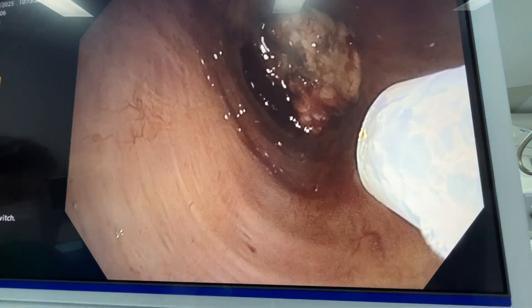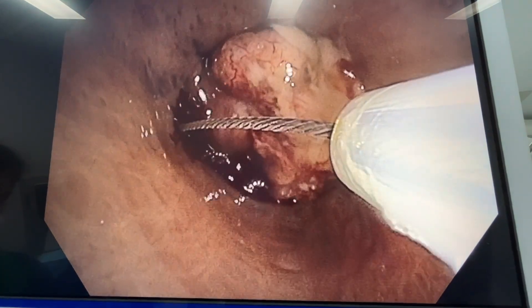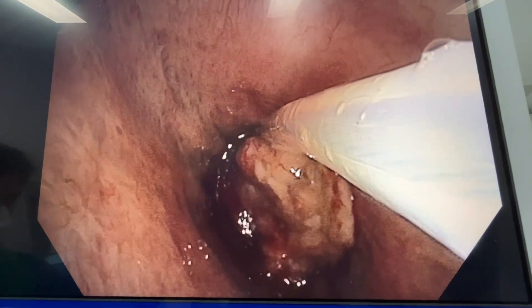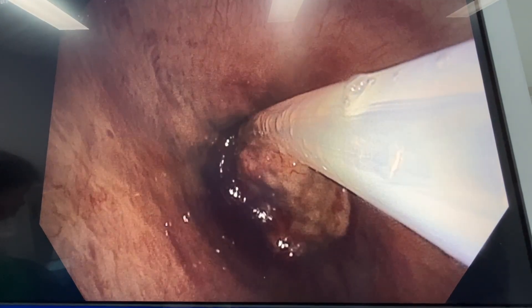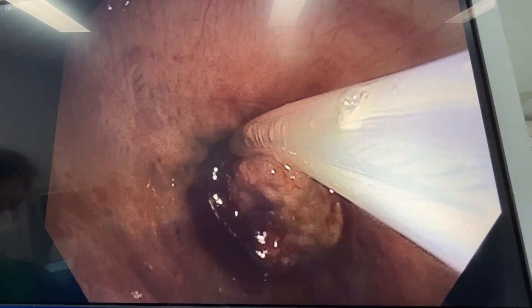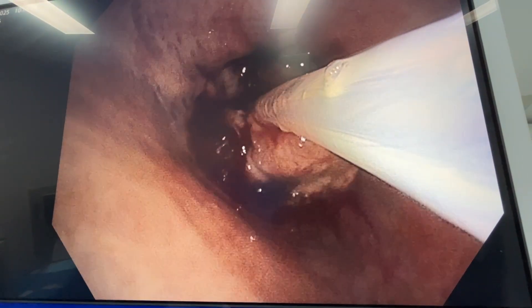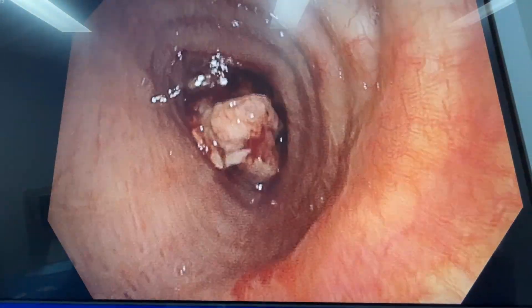First, I'm going to use a loop diathermy — I loop it around and use heat energy to resect as much of this as possible. I loop it around the tumor, apply diathermy heat energy, and it will cut through that — a big section of that tumor. You can see it just cutting through there, and the probe will come free. You can see I can start to move that tumor now. I'll remove the loop diathermy.